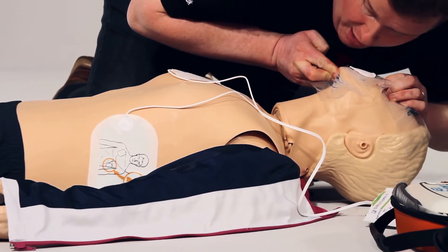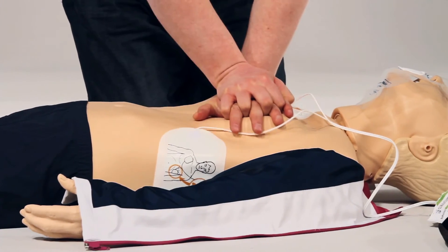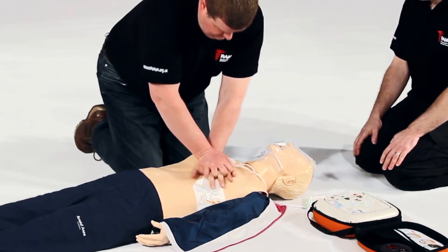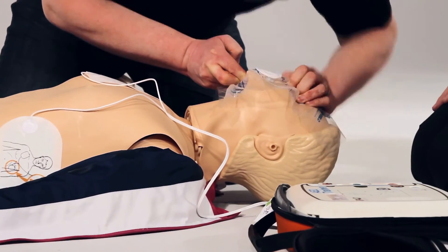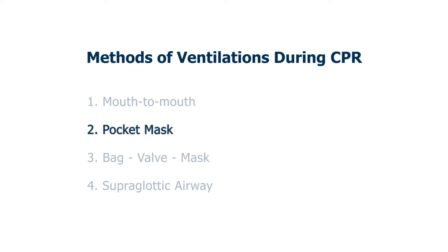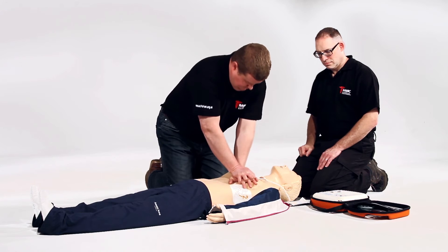Breathe, breathe — second. Breathe, breathe — third. Breathe, breathe — third. Carry on. Begin CPR now. Press the flashing blue I button for CPR voice prompt.